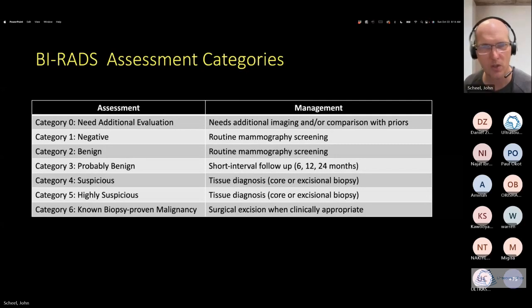And so does it make sense to have all these different categories? Well, truth, it does matter if you need a nuanced view of it, but from a sonographer's perspective, it doesn't matter because you're not going to be doing the biopsy. You're going to be sending them somewhere else to do the biopsy. And so what you're using ultrasound to do is, does this woman need to go in and have a biopsy? Can I follow her with my ultrasound at 6, 12, and 24 months, or can they just go back to their communities and not have follow-up?